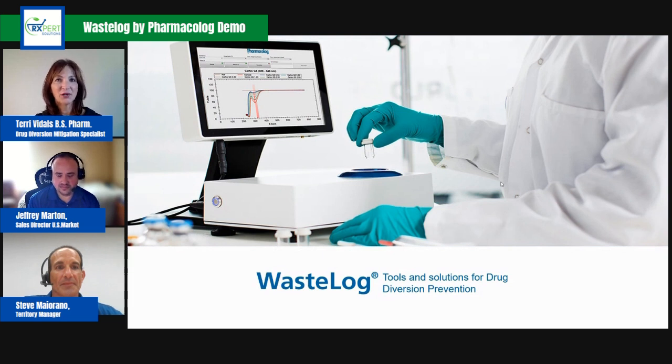About a year ago, I interviewed them regarding their product, Wastelog, and I've invited them back to do a demo of Wastelog for us, which is what they're going to be doing. But before we jump into that demo, maybe you could start by just giving us a nice overview of how the equipment is best used within a facility. For example, is it meant to be used by the end user on the floor or by the pharmacy? How do you recommend and what do you see as the best process? Just kind of give us that overview.